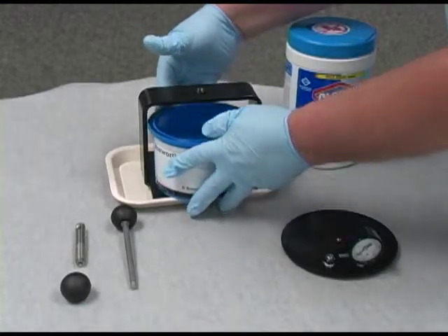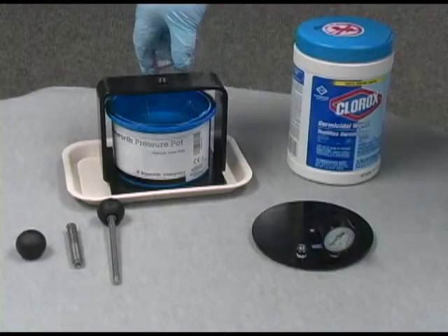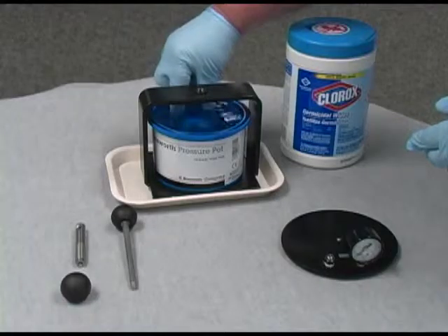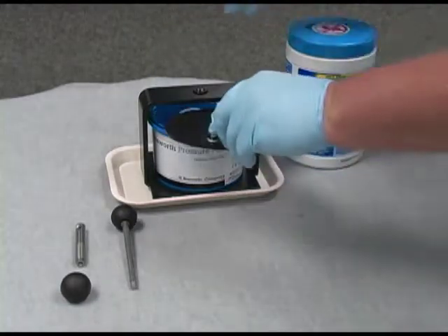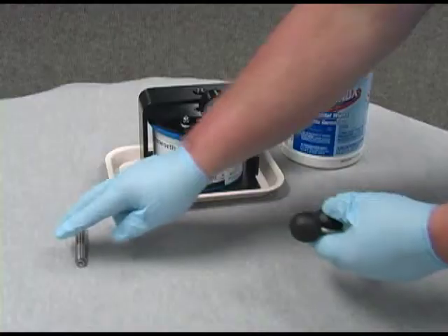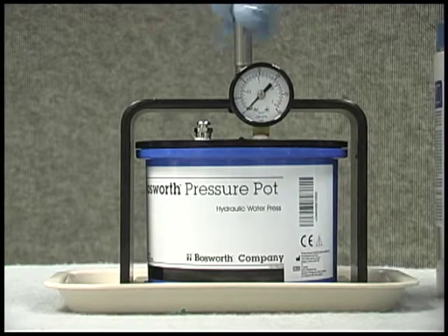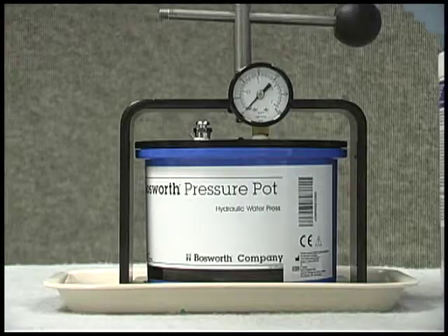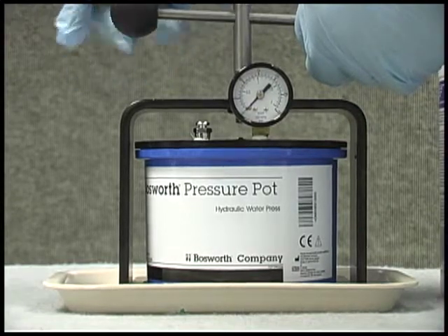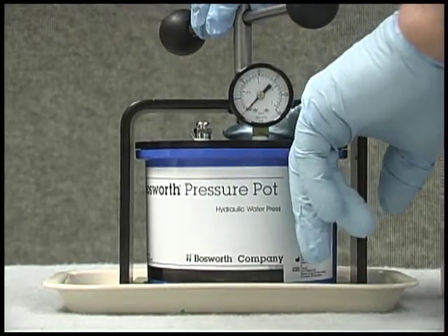Insert the pressure pot into the frame and back until it rests against the alignment pins. Fill the pressure pot until it overflows. Place the acrylic into the pressure pot, after which you'll place the lid onto the pot, and then insert the pressure pot handle.